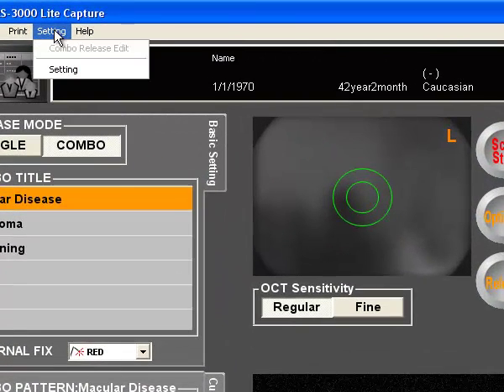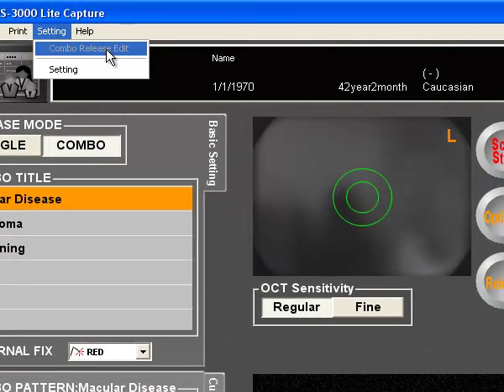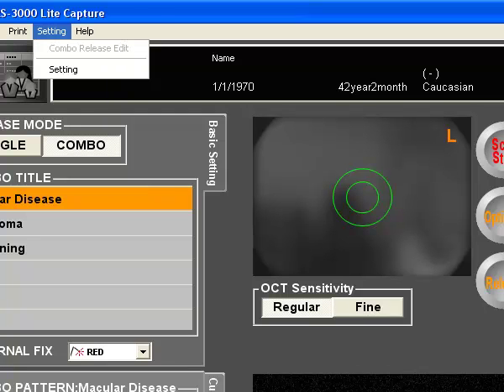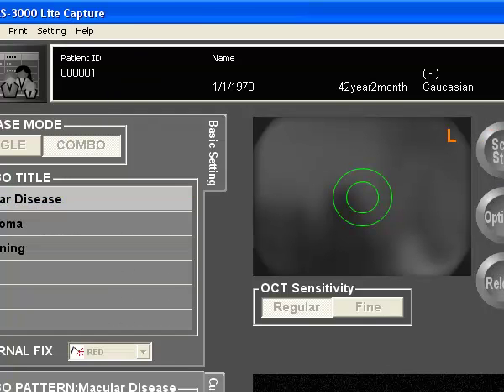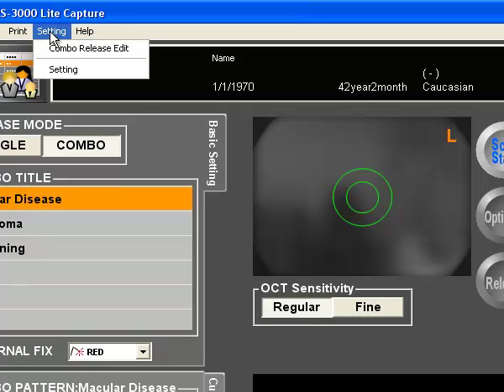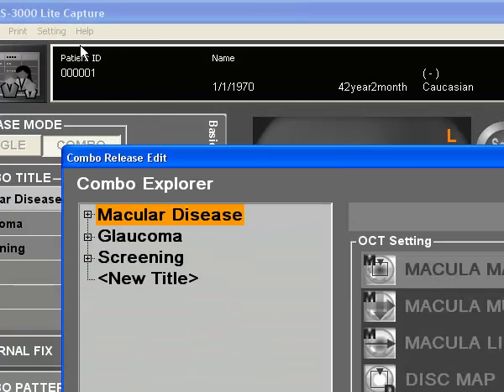To set these, go to setting and there will be the combo release edit. If this is greyed out and you are unable to click it, you need to stop the scan by hitting the scan stop button, back to the setting menu, and the menu should then be able to be pressed.